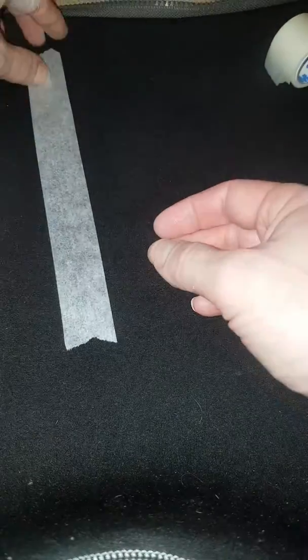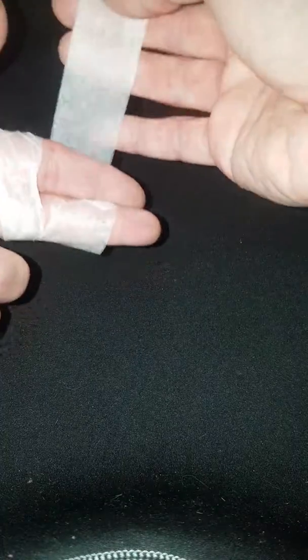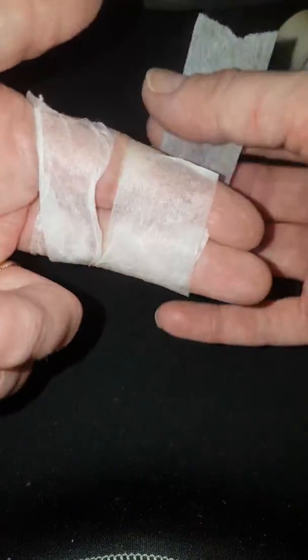That's the first one — I can still bend and they're fine. Then the second one, same thing: start on the uninjured finger, start it from literally underneath like that, and then the same principle, going over the top. Put them together and let the tape pick up its tension — don't pull it really tight. Neither of those fingers have got circumferential bandage on them.